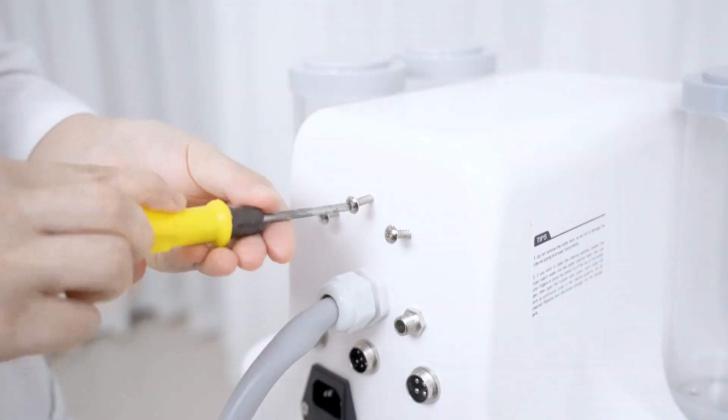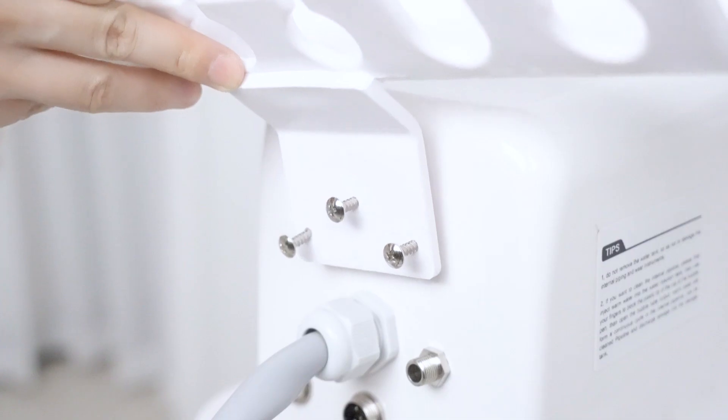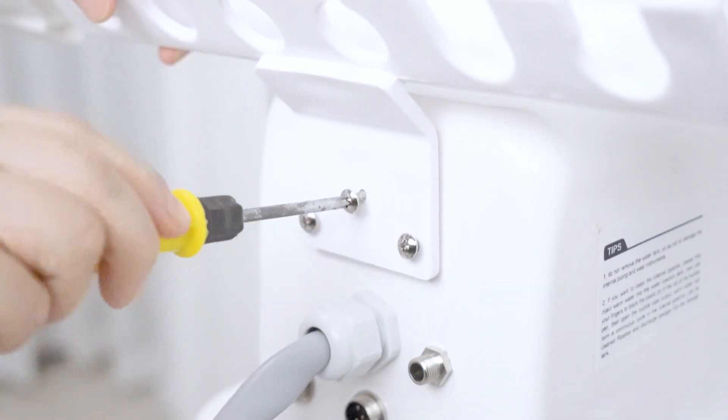Take out the screws and start to install. Aim the handle holder at the right place and twist the screws into the machine.